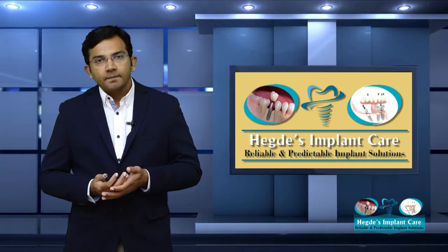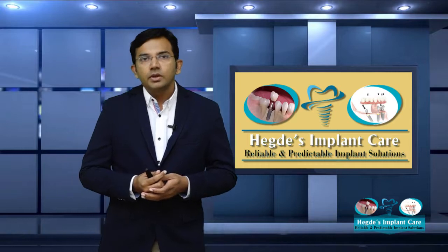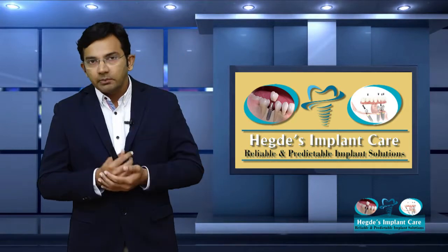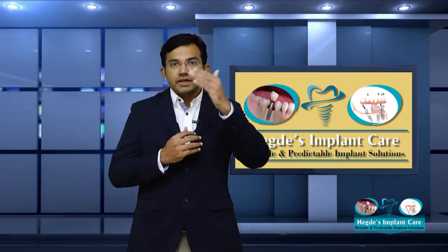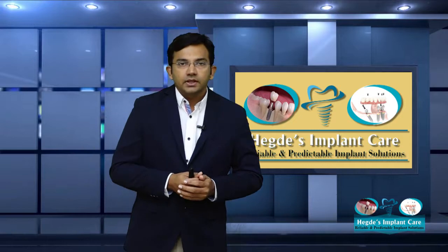In this particular case I have planned an indirect approach, or the crestal approach. Why have I selected this? Generally, the indirect technique is a simple procedure. We do it in cases where we have to lift about 3 to 4 mm of sinus and augment the bone. So in this particular case I have done that.